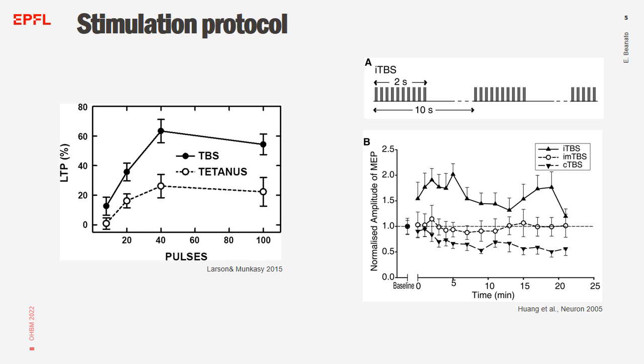In this specific case, trains of 2 seconds of stimulation are delivered, followed by 8 seconds of break. Each train is composed of 10 bursts at 5 Hz, the theta component, and each burst is in turn composed of 3 pulses at 100 Hz.